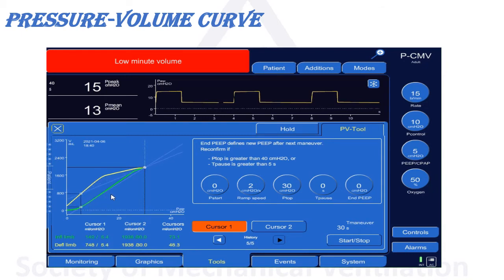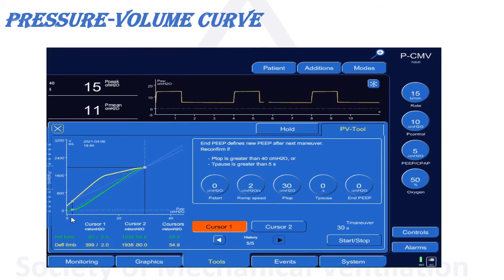So in all these examples, the point is, if you put your PEEP so low, like at 2 or 3 or 4, as in cases of ARDS, that lung will close at the end of exhalation, and you have to reopen it next breath. And that opening and reclosing causes atelectrauma.